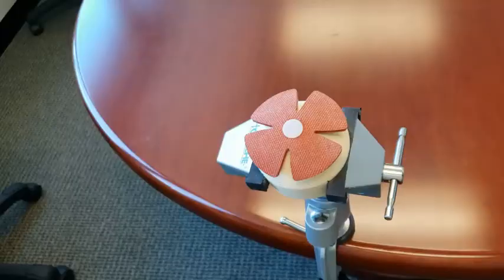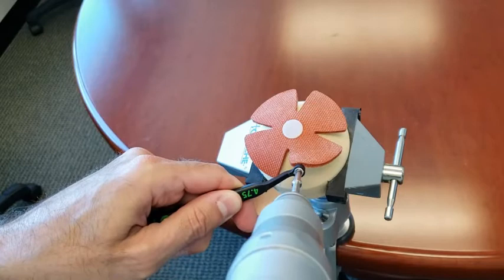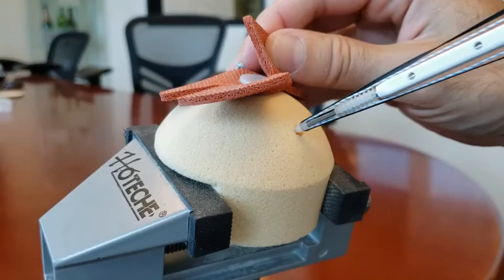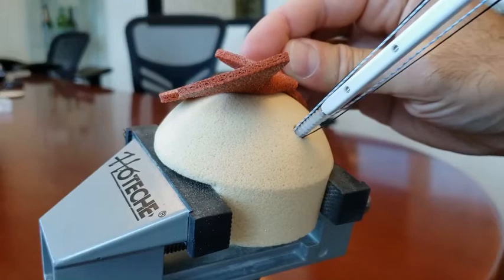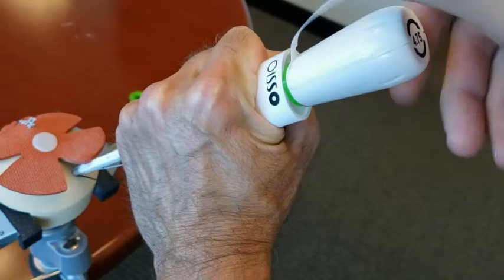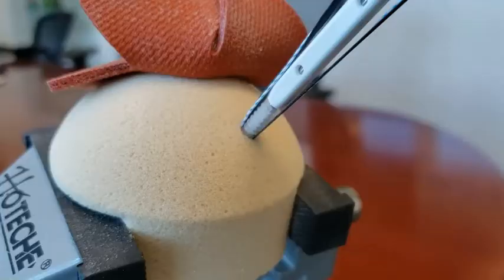We start by drilling with a drill and drill guide through the drill stop. We next insert the eyelet into the prepared hole and mallet down until the first couple of threads reach that hole. Then, grabbing the handle with one hand, you're going to turn the knob clockwise and the anchor will start to thread itself into the pilot hole.